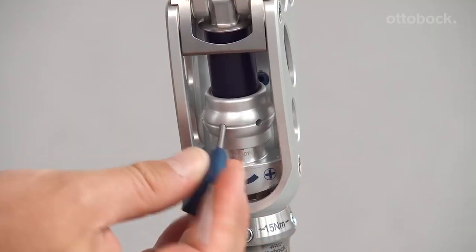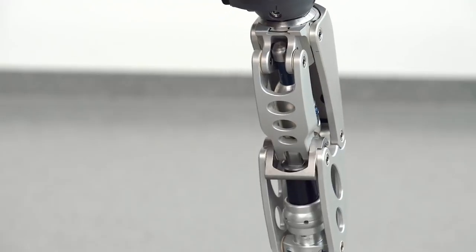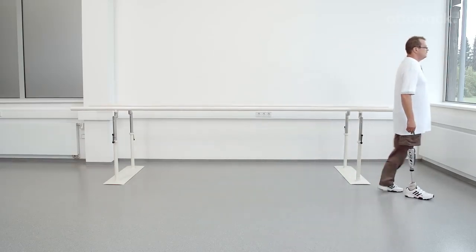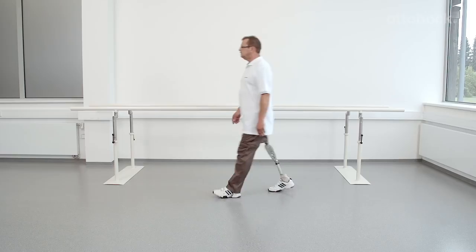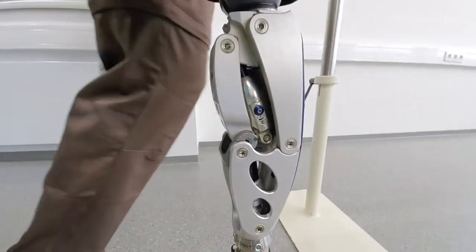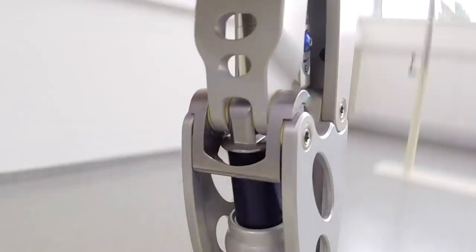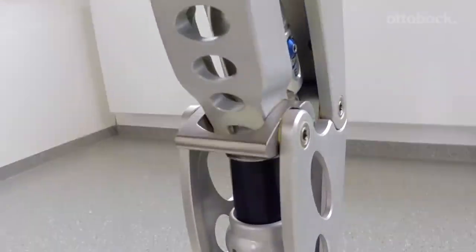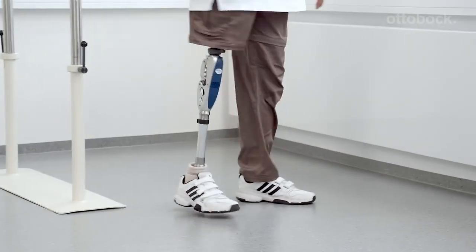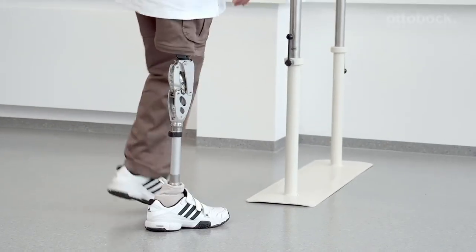Knee flexion is controlled at heel strike by an elastomer element, and stance phase flexion is in the range of 0 to 15 degrees. The EBS can be adjusted for different body weights and activity levels via the adjustment ring. To see if the swing phase is set optimally, the user should walk at varying walking speeds. Equipped with a powerful hydraulic and a unique joint construction, the 3R60 controls all swing movements of the prosthesis even at higher walking speeds.